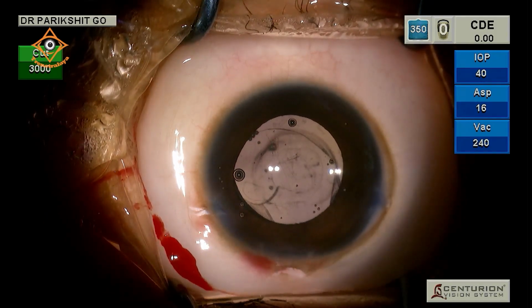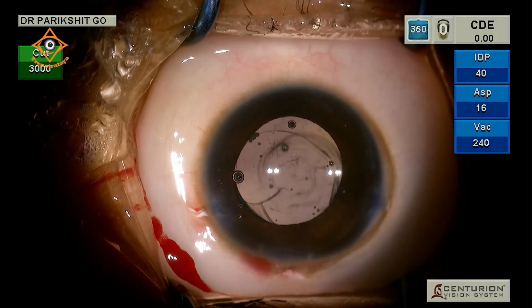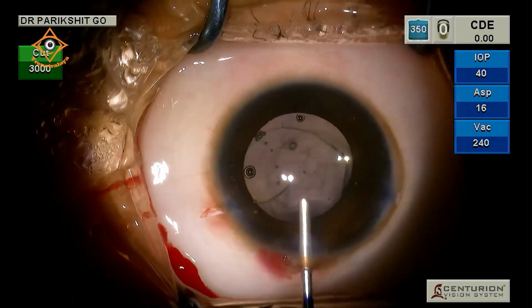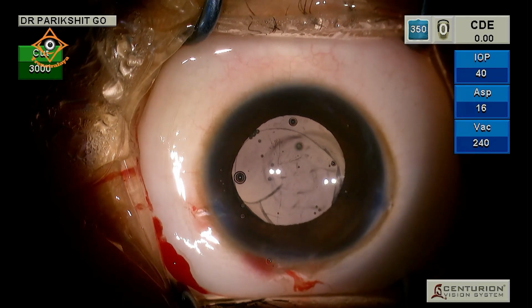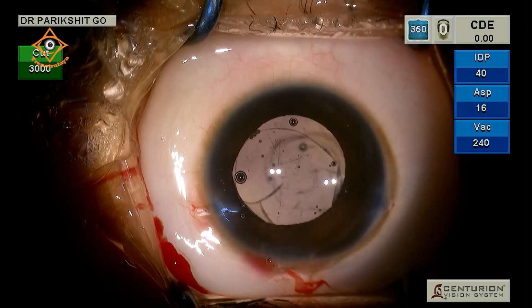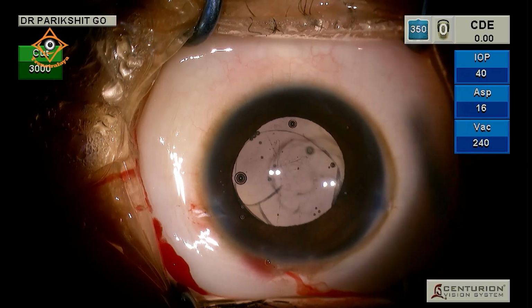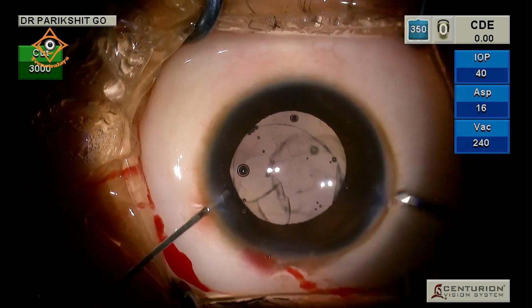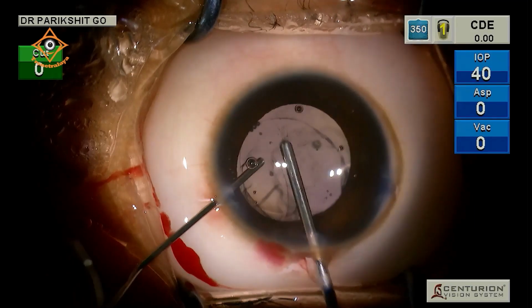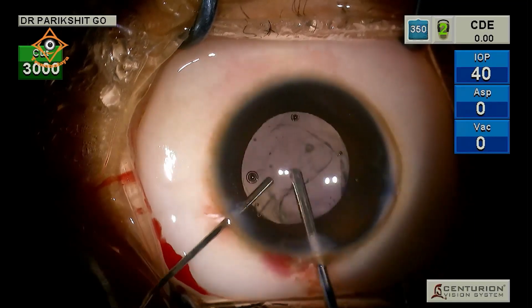Give visco, a cannula smaller than this will not do. Now we just want to see how much of the visco we have cleared. I can see the blob of visco that has gone behind the lens, which I will need to remove. And once that is done, put in an air bubble to see that this lens is covered on all its sides, except perhaps superotemporally, by the anterior capsule. And once that is done, I think we are done with the surgery.